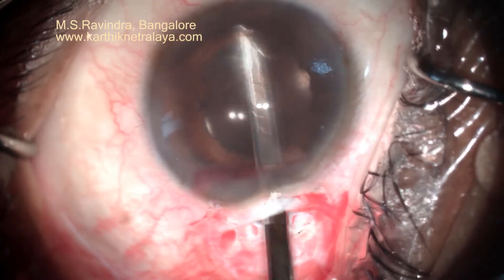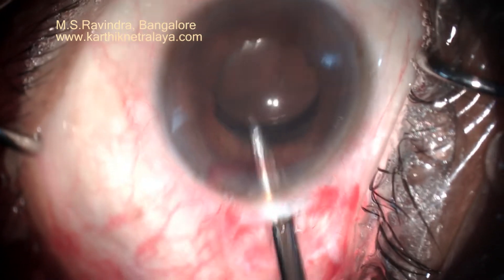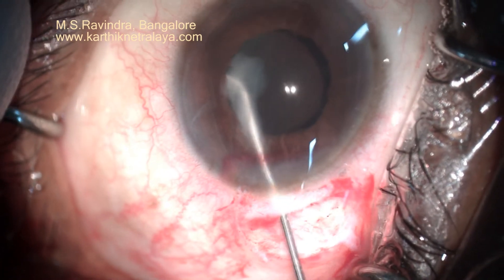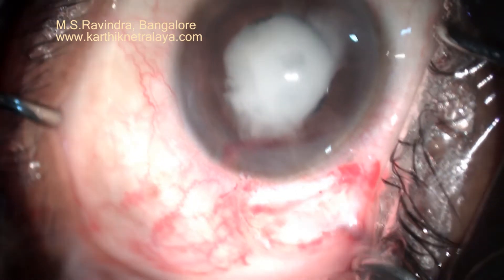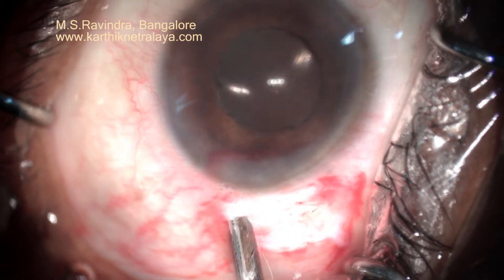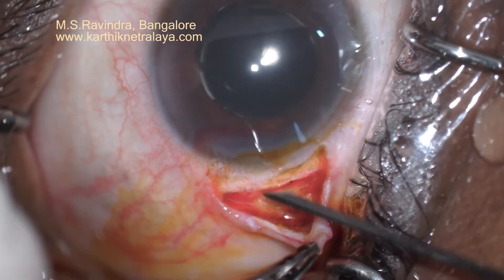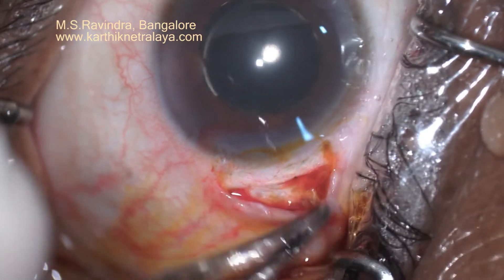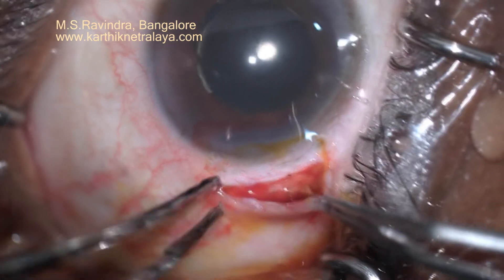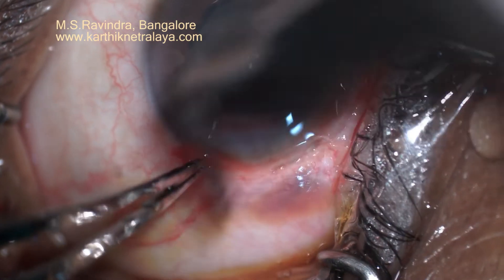This is one of the ideal ways to implant the lens inside the capsular bag. Viscoelastic has to be completely removed, and I am injecting between the anterior capsule and the iris, close to the zonules, a small amount of triamcinolone — and that is the end of surgery. That is how I form the chamber. Most of the triamcinolone is absorbed back, and I put a drop of betadine followed by fibrin glue to seal the wound. Because I have not opened the eye at any other point, the single point of entry is closed adequately with the conjunctiva.